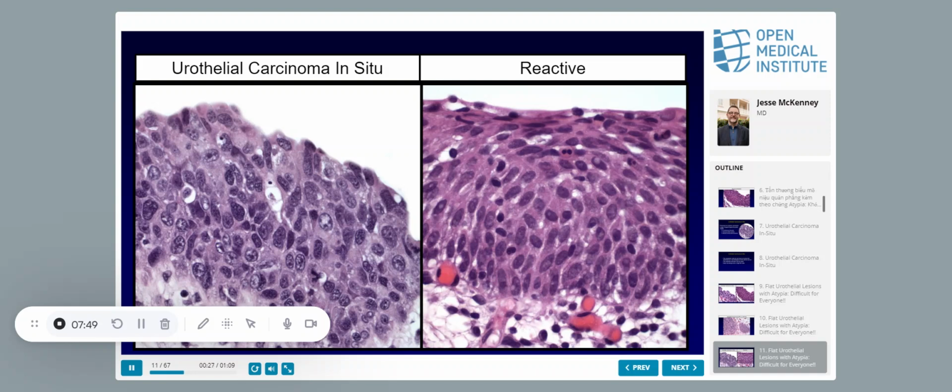this is marked nuclear hyperchromasia. Very coarse, they're rounded. It's kind of lost the orientation again. So again, to me, this is florid carcinoma in situ. This is the first step. You've got to learn how to recognize this, because everybody should call this carcinoma in situ.